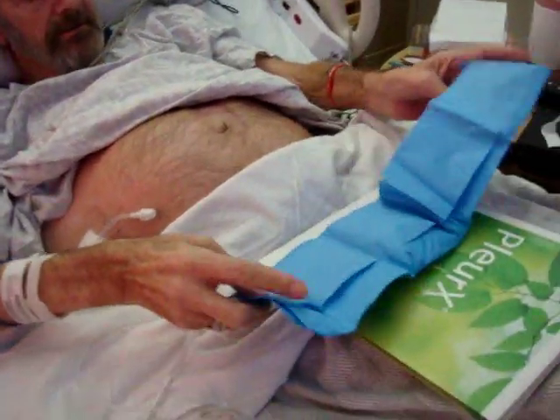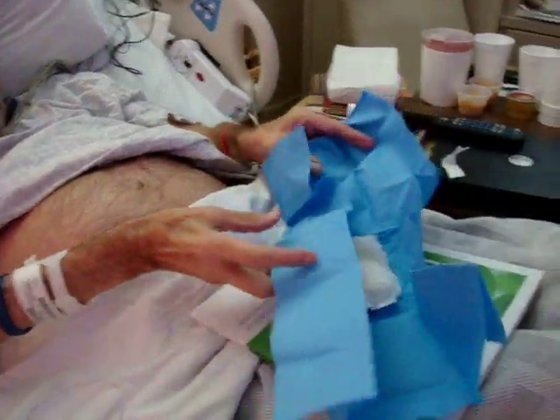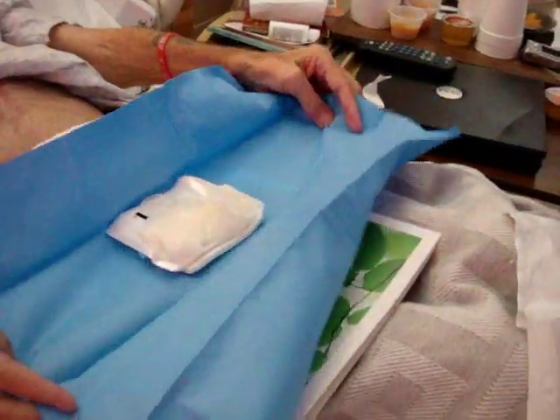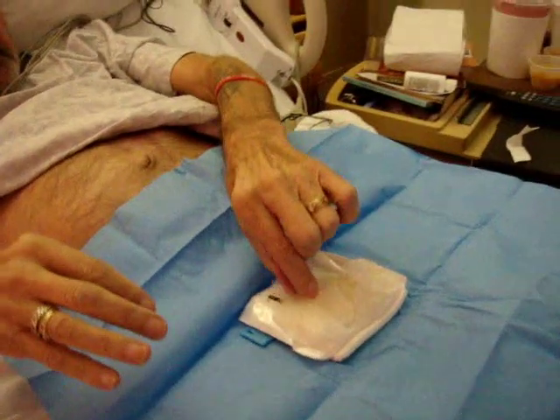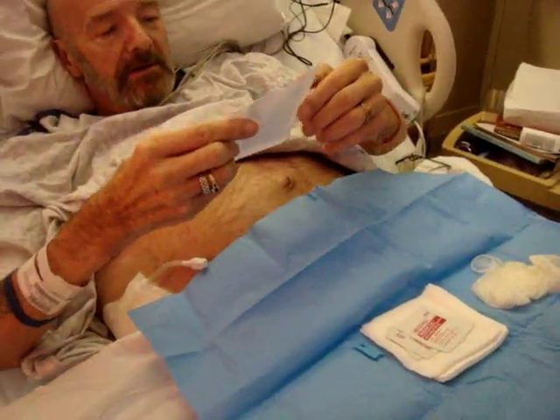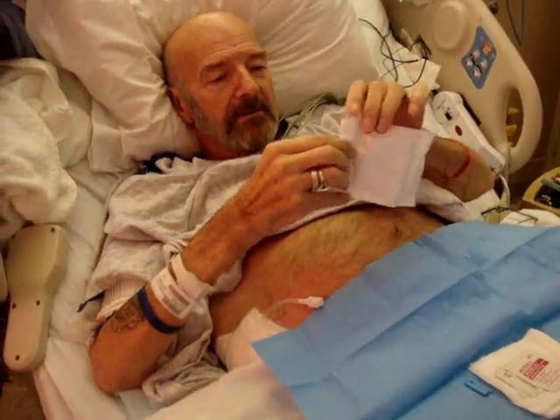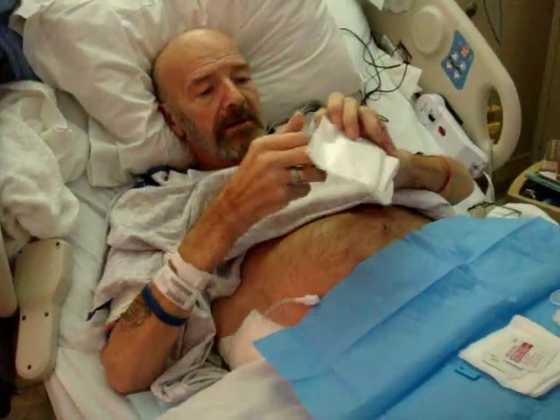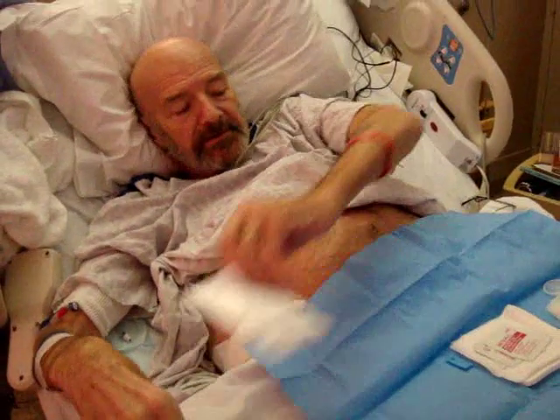Now we have the sterile area — this is the area that must be kept sterile. Handle it underneath so that you don't touch the top part, which is the sterile field. I'll be keeping everything in the middle of the sterile area. I don't need to wear gloves — I've read the instructions over and over, and it clearly says that you don't actually need to wear gloves when doing this yourself. It makes it a little easier to work without a big footy glove.